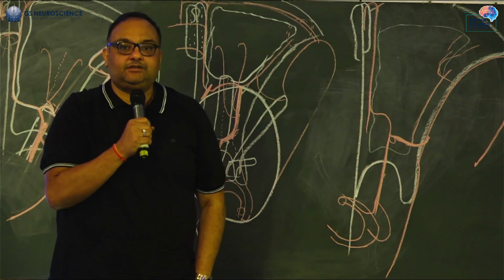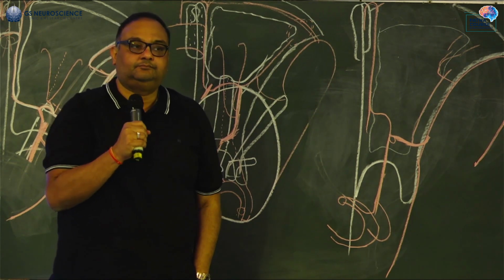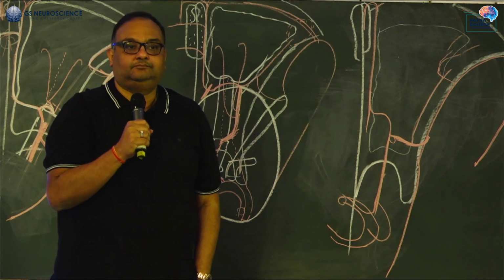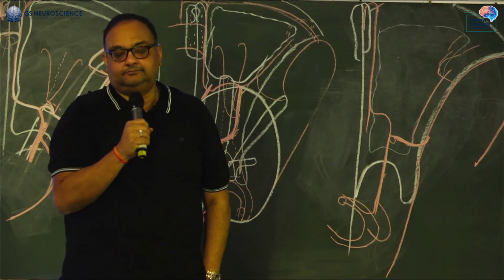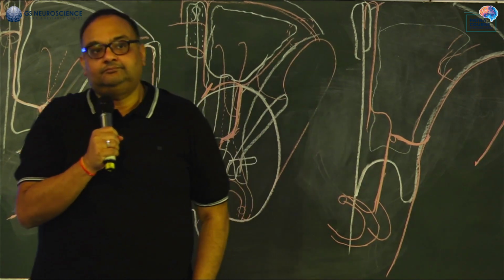Any more questions? Even by going with the venous route, it's very costly. You'll have to have a balloon, make a pressure cooker. Onyx, again, the amount of Onyx that you'll use in the venous route increases. So the cost goes very high. If I'm given an option of arterial versus venous, I'll first try arterial because the cost is almost double when you go for venous. The balloon costs you a bomb, then Onyx, everything.